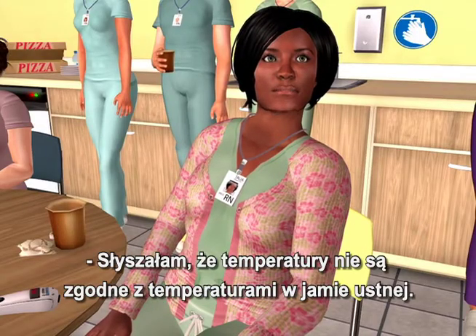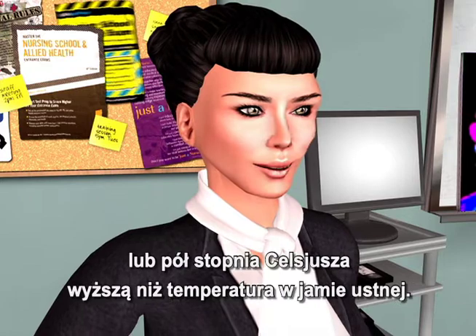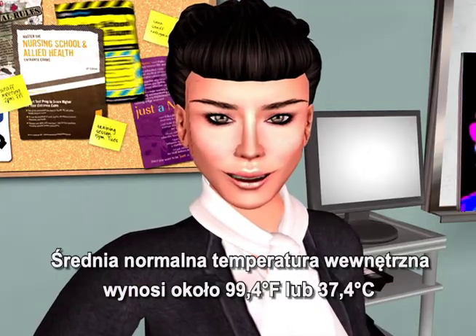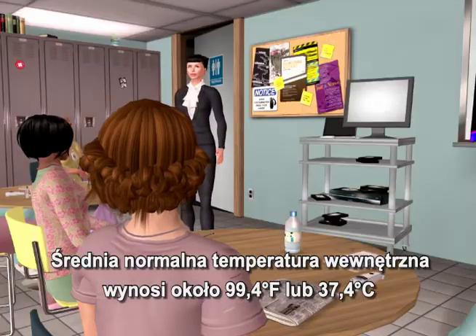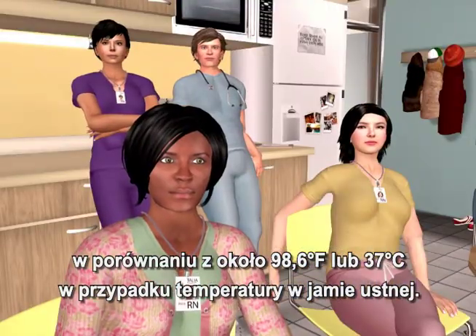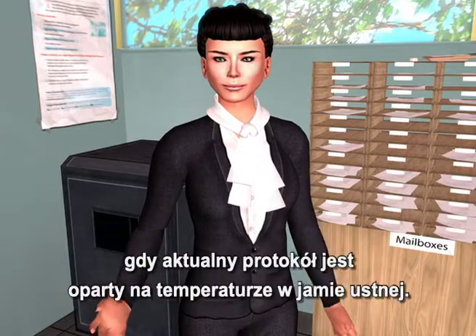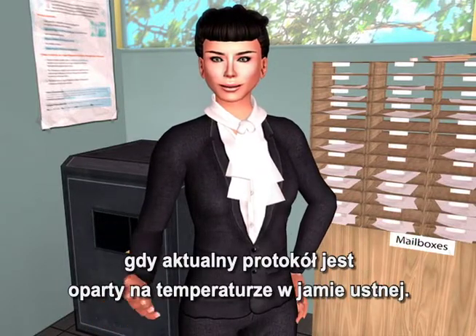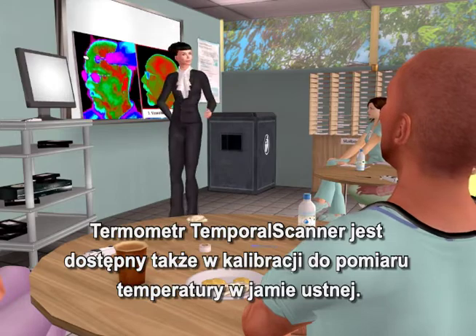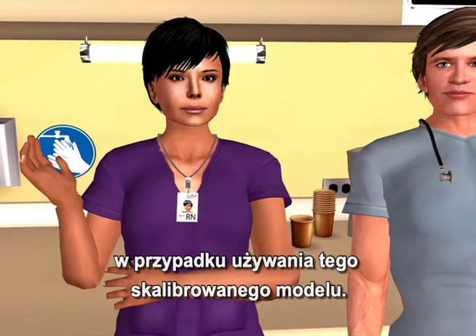The temporal scanner is measuring core temperature, about one degree Fahrenheit or half a degree Celsius higher than an oral temperature. The mean normal core temperature is about 99.4°F or 37.4°C, versus about 98.6°F or 37°C for an oral temperature. FIVA protocol will need to be adjusted upwards if your current protocol is based on oral temperature. The temporal scanner is also available in an oral equivalent calibration, so no adjustment is required if you're using that calibrated model.